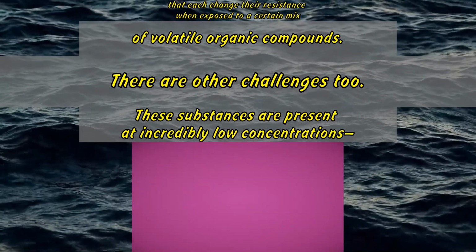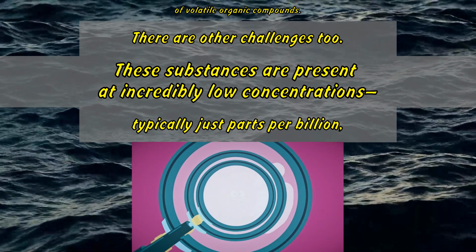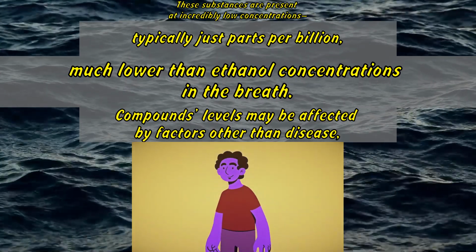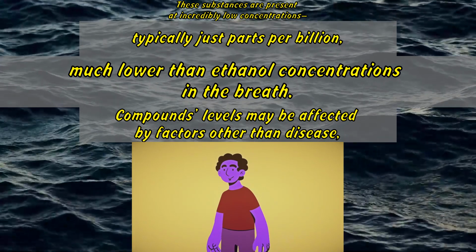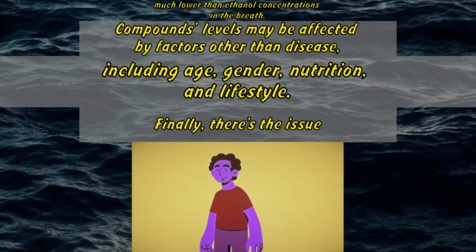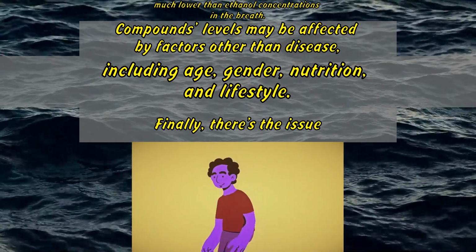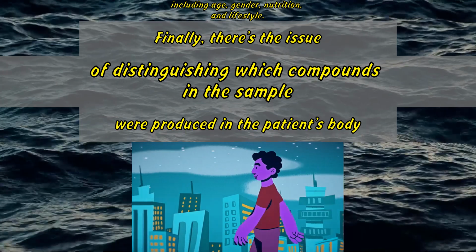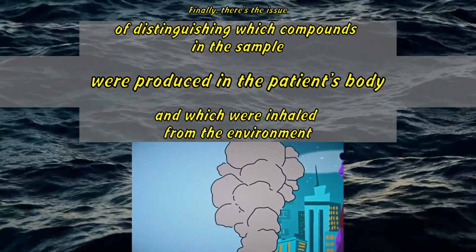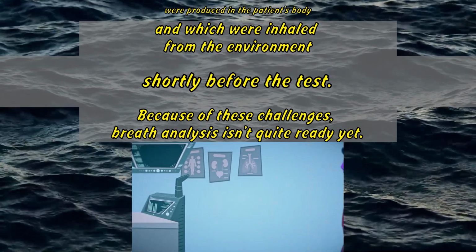There are other challenges too. These substances are present at incredibly low concentrations, typically just parts per billion, much lower than ethanol concentrations in the breath. Compound levels may be affected by factors other than disease, including age, gender, nutrition, and lifestyle. Finally, there's the issue of distinguishing which compounds in the sample were produced in the patient's body and which were inhaled from the environment shortly before the test.